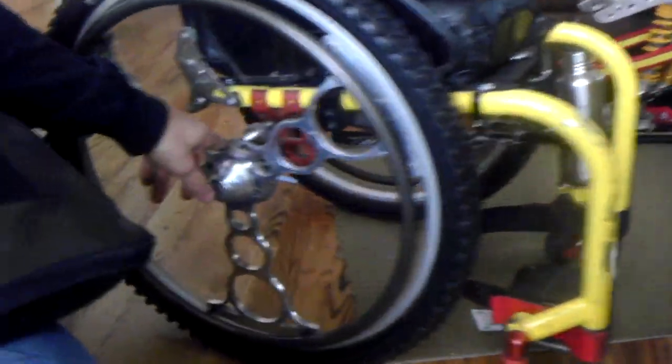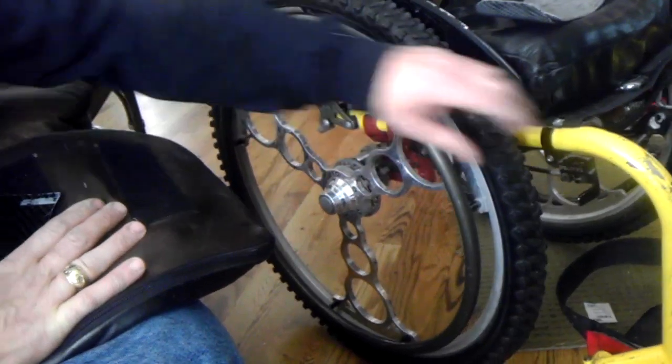This is the seat belt. Cell phone holder. Love these brakes — these are these locks. The most awesome brakes ever. They just do a great job. Can't say enough about those.